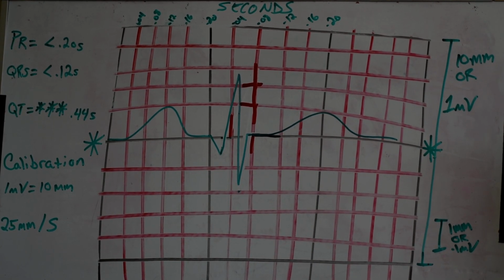I did a video before talking about the very introduction of the electrical current as it pertains to the anatomy and the readout on a sheet of EKG paper. Now, as it's drawn up here, you will notice on the whiteboard there are black lines on the grid and there are red lines on the grid. Now, on your actual EKG readout, it's not going to look like this. It's going to look like a piece of grid paper where every line is black. But I will show you in a second why I have the lines marked off as black and as red.